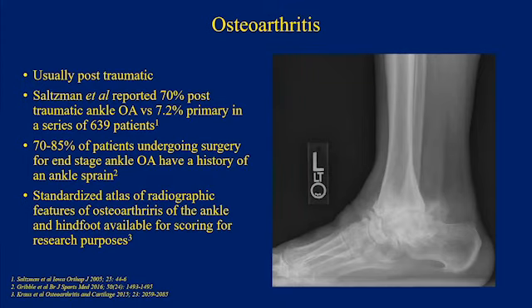Next. So in summary, there are a plethora of imaging modalities available to evaluate, treat, and follow patients with arthritis. Next. Radiographs certainly remain the mainstay of imaging. Next. CT is better used to delineate erosions and cysts, and it's often used in the setting of pre-surgical evaluation, whether you're going to do an arthroplasty or other additional bony work or possibly go on to a fusion.